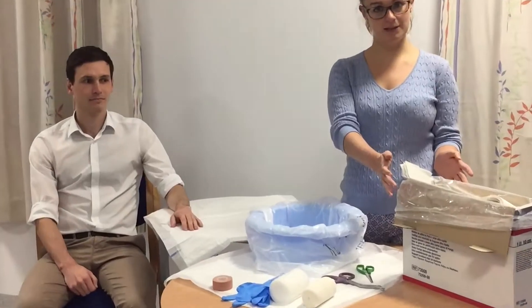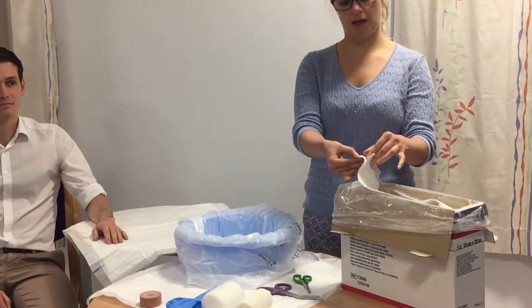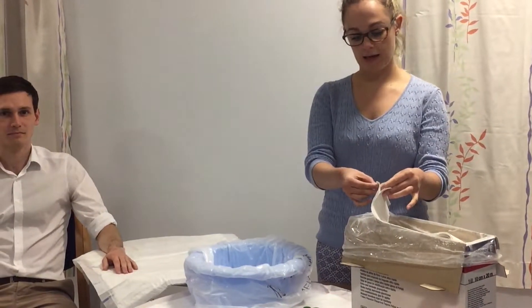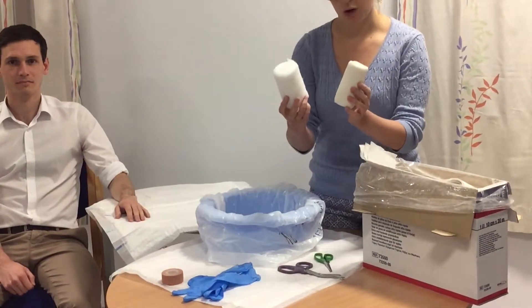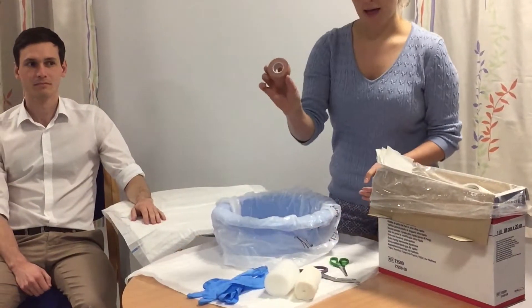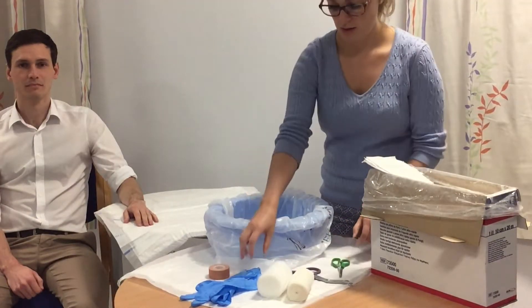The equipment that we need: some sheets of plaster — these have five sheets in a strip — and then we need some crepe, some wool, some pink tape, scissors to cut your plaster with, and gloves are always a good idea because plaster gets absolutely everywhere and it's horrendous to get out of your nails.